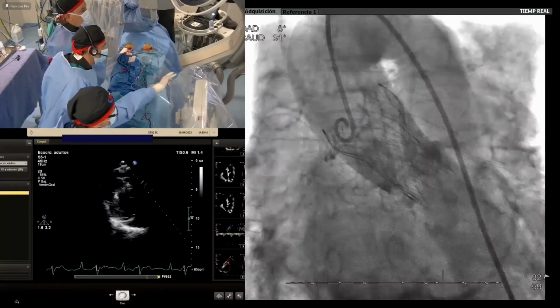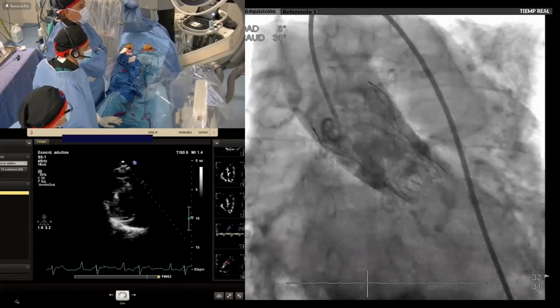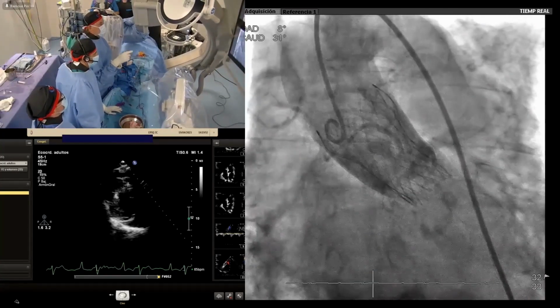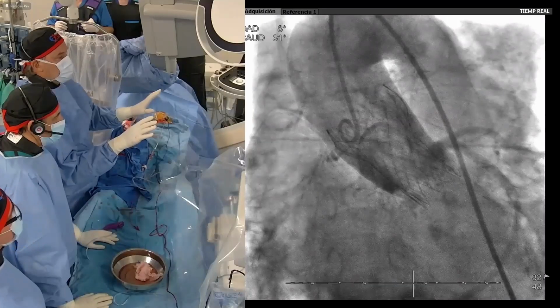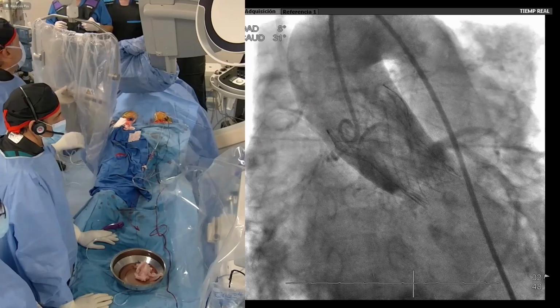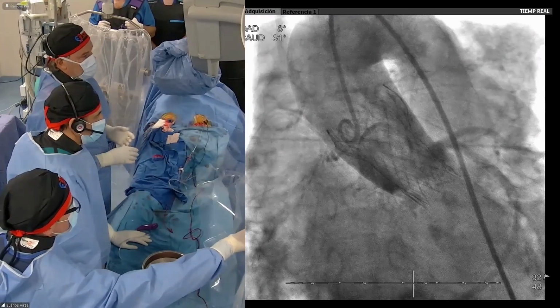Probably give the right hand to Dr. Salmo. According to this image, one more. Let's stop more. Like here. Here, you can observe probably the valve is 2 or 3 at the most in the non-coronary cusp. So we cannot go higher. So the cusp alignment is okay.